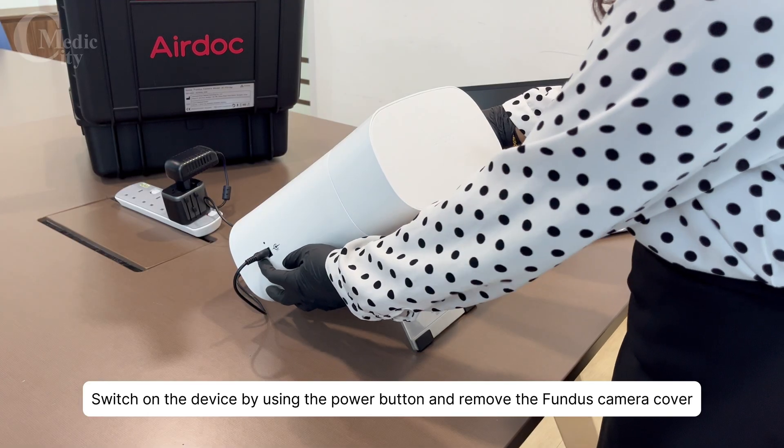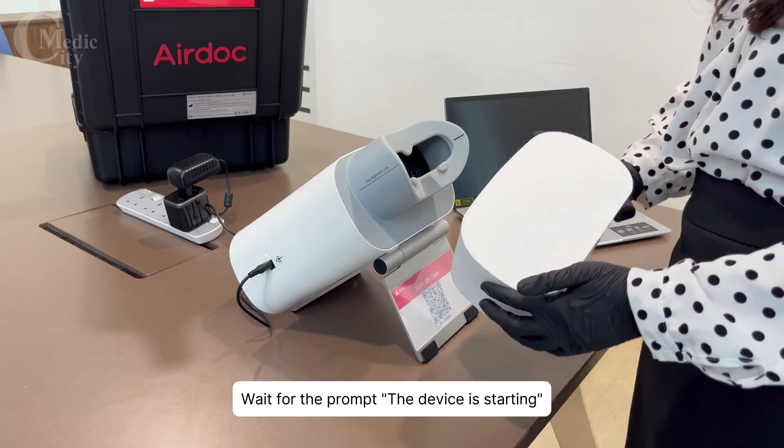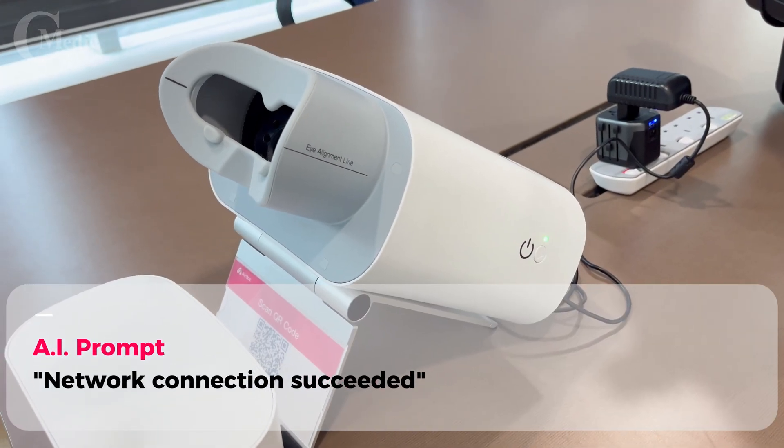Switch on the device by using the power button. Remove the Fundus Camera cover and wait for the prompt — the device is starting. Once the device has started, you will see the message: Network connection succeeded.